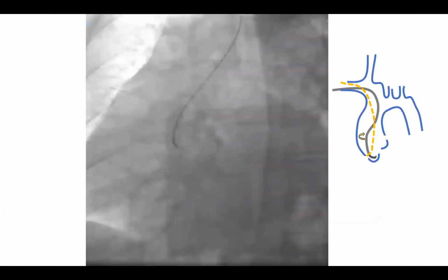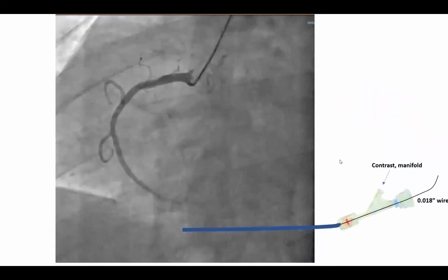Anybody knows what's the risk really? What's the big risk when you keep torquing and not transmitting the torque? Whenever you're doing this in a difficult case with a lot of tortuosity, you keep torquing, not much gets transmitted. You need to have one big worry as you're doing this. Anybody can tell me what this big worry is? I think you can twist the catheter so there's a kink, or maybe it can partially fracture. Excellent. Yes, catheter kink. You should be obsessed with that.